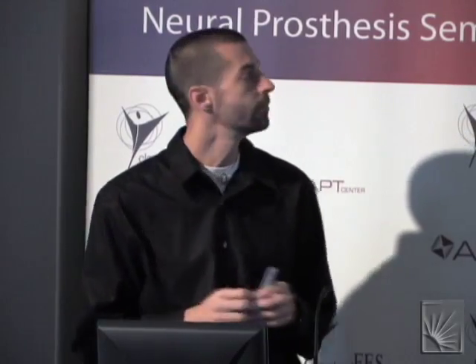So from an engineering perspective, I wouldn't advise it. But as the technology advances, those things will change. There are new devices coming out that will have multiple channels. They'll be current controlled. And now we're looking at how we could do some current steering across different contacts, and shape those red blobs to be something more than just spheres, if you will.